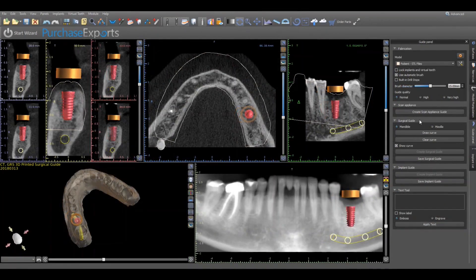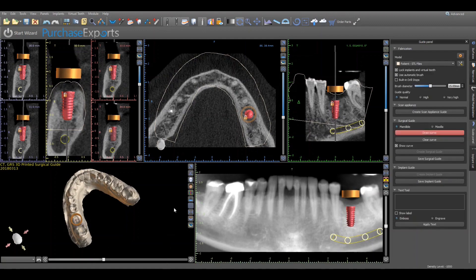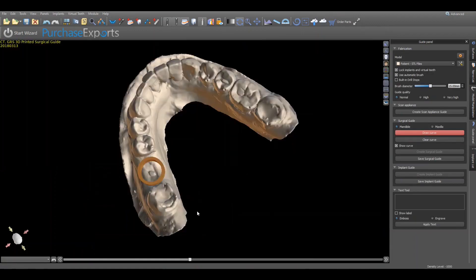Now to design the surgical guide, confirm either mandible or maxilla and then click on draw curve, which will automatically lock all implants and teeth in the plan position prior to designing the surgical guide. Make sure that the virtual model is completely opaque and all transparency has been removed by clicking on the surfaces tab, highlighting the model to be used, and removing all transparency under the material subheading by using the slider bar to the right. Once completed, click on the maximize button associated with the 3D virtual model and orient the model to get a clear view of the patient's oral anatomy.